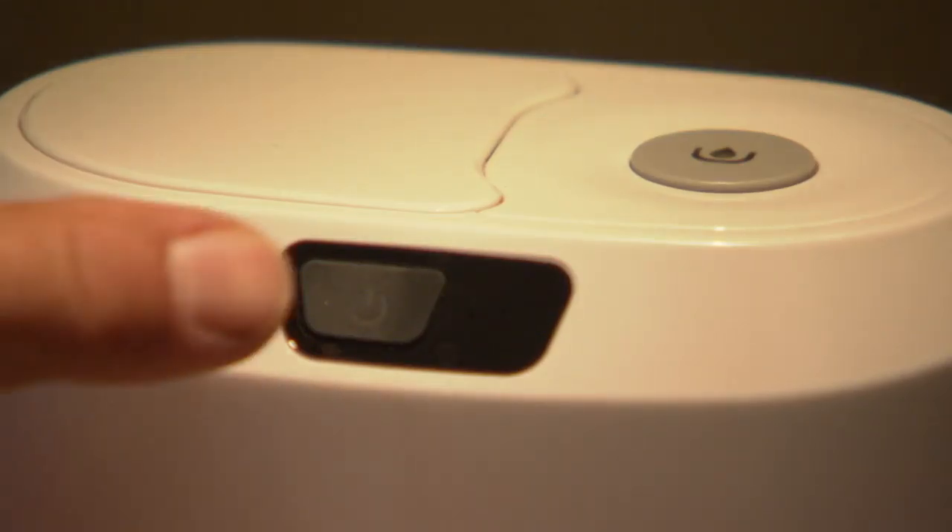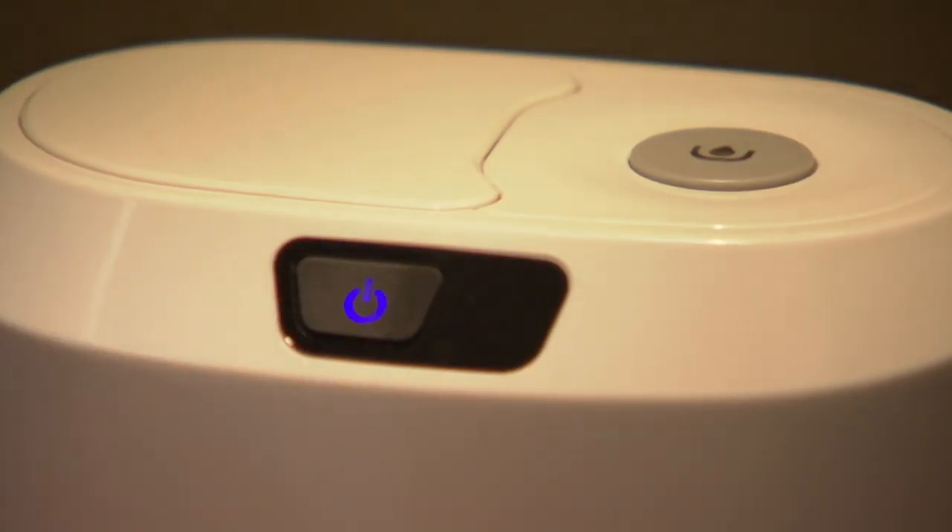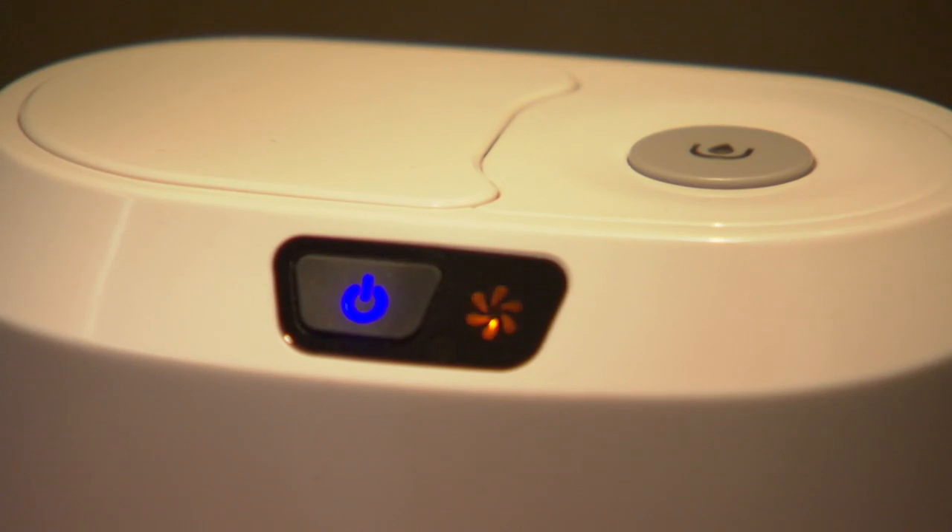Push the power button to turn the console on. The power icon will flash blue for a few seconds as it warms up. The icon will turn solid blue when the unit is fully powered on.